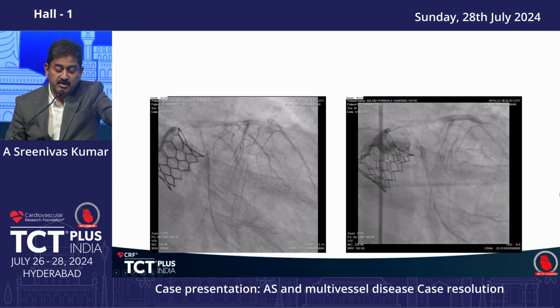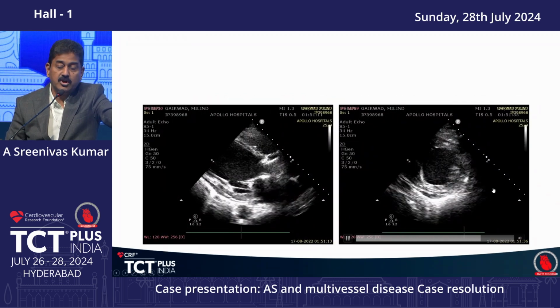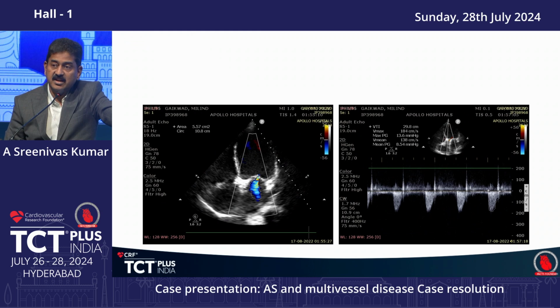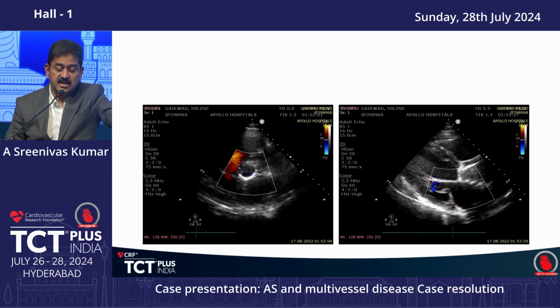So immediately, the beauty of this TAVR as well as the procedure is that LV improved, though it didn't become totally normal, but immediately it had a dramatic symptomatic improvement, first off inotropes, and the patient became all right. MR also was slightly decreasing.